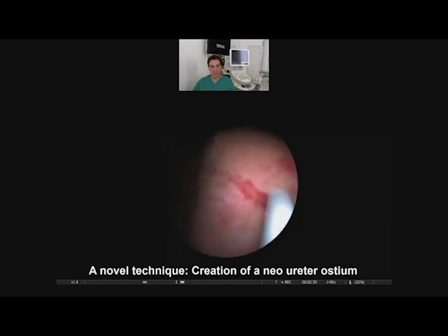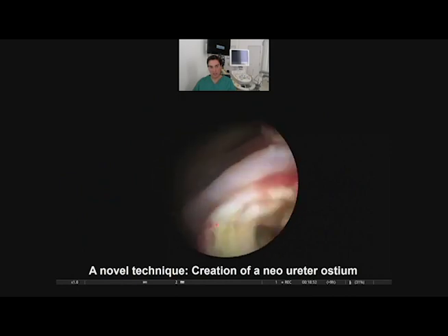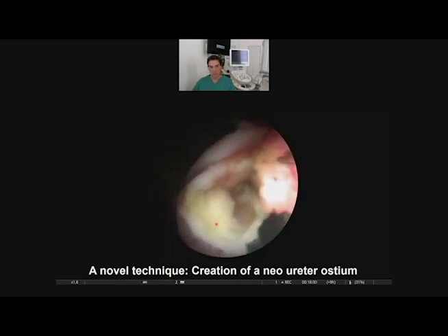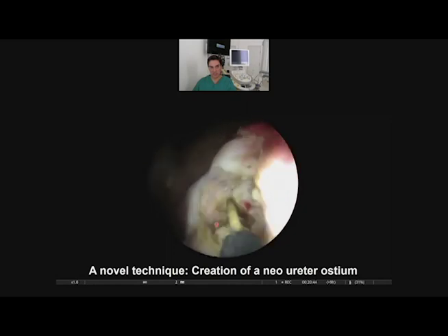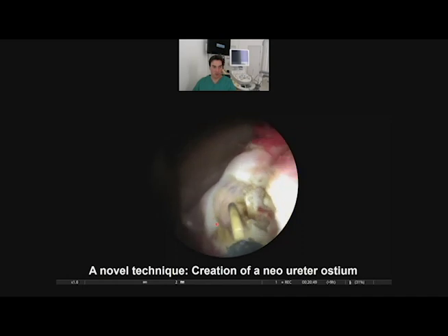The patient has a nephrostomy before, and they go with a guide wire under. And what we do now, higher on the lateral side, on the right side, we search with a needle, go through the bladder, and search for the other side of the ureter. We saw in ultrasound that 3.5 centimeters from the ostium, the ureter is dilated. I cut it now and I search. It's like building a tunnel between Europe and England. So we do it now in the same way.